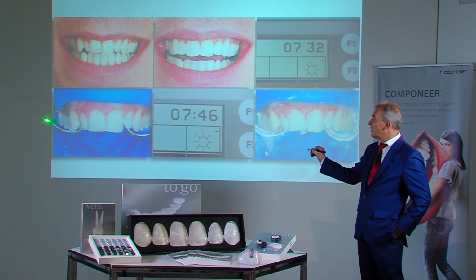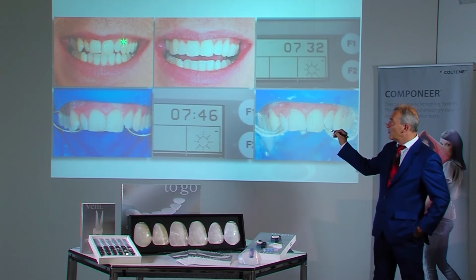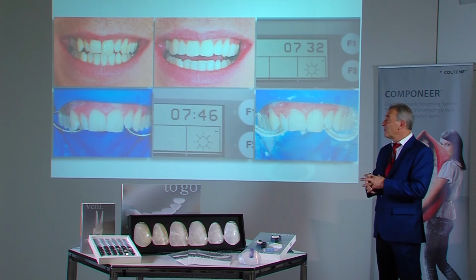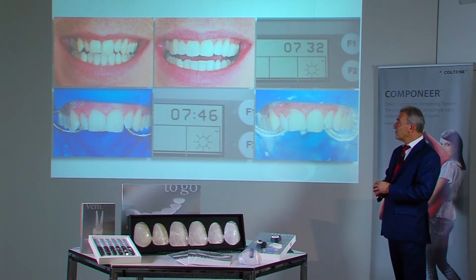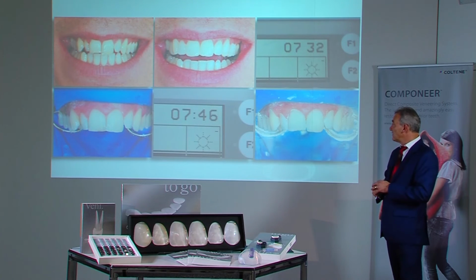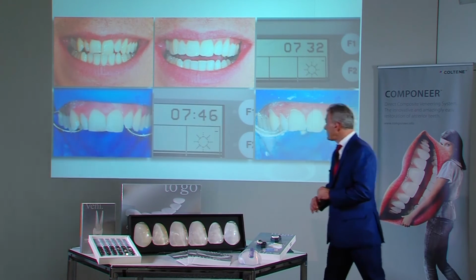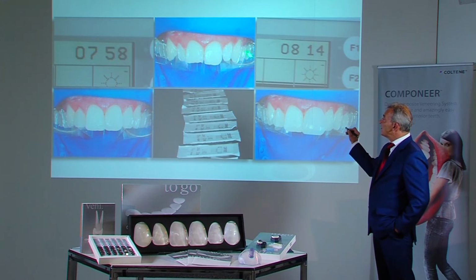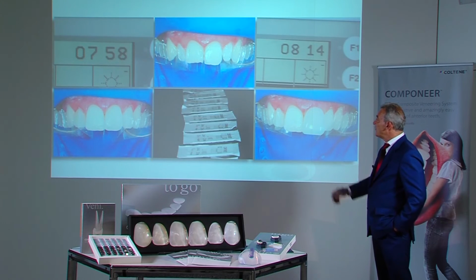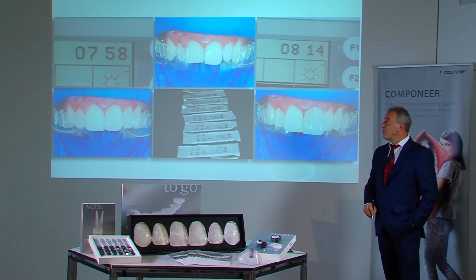The teeth are prepared and bonded. Again, one can see that the preparation is not really a major preparation. The 2 has to come forward, the 1 was roughened on the outer surface, and the rest needs to come forward a bit. One could therefore do without classical preparation. And this is what it looks like, prepared with matrices and bond for the matrices. And then a whole brigade of componeers was arranged for placement.